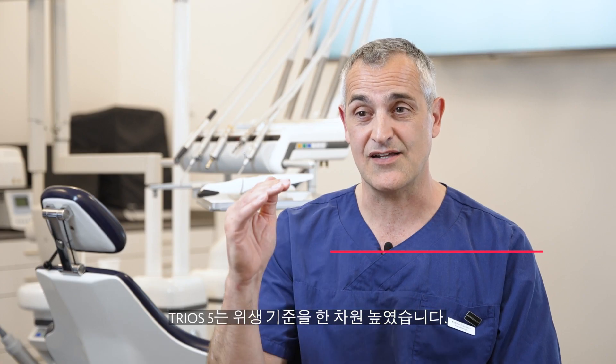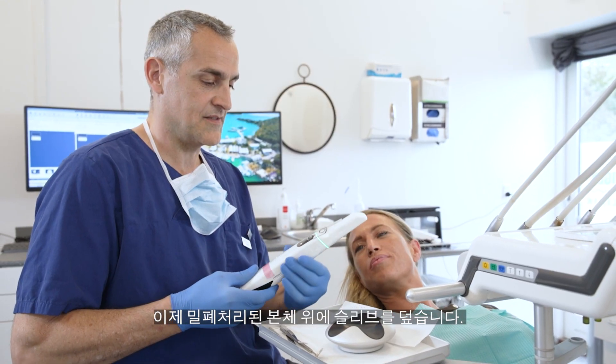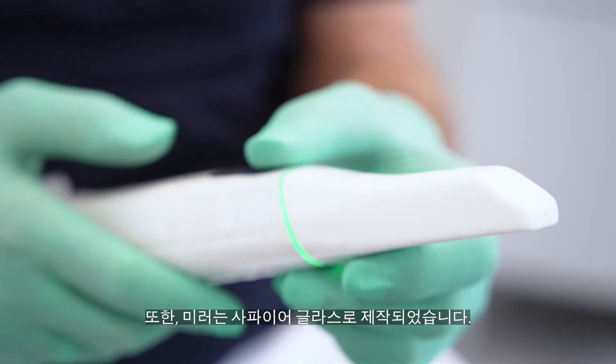The Trios 5 is on the next level in regards to hygiene. Now you've got this enclosed body and you have the sleeve over it, and then you have the sapphire glass. I really love the round edges around it, so it's very easy to clean.